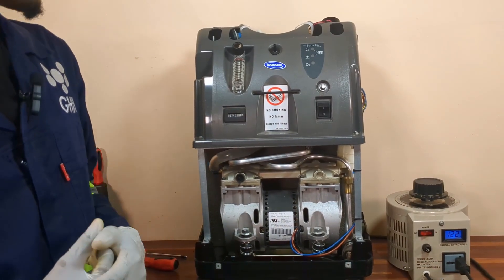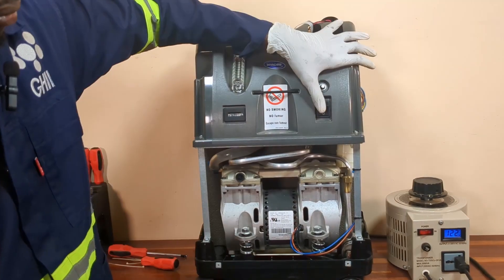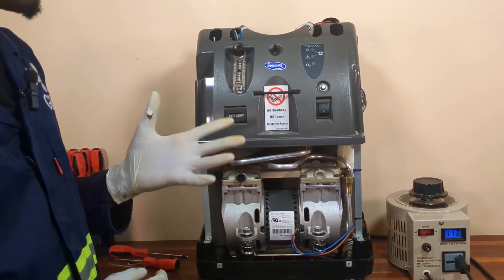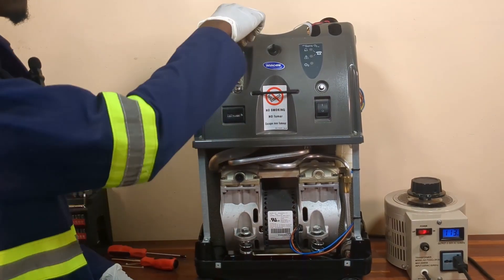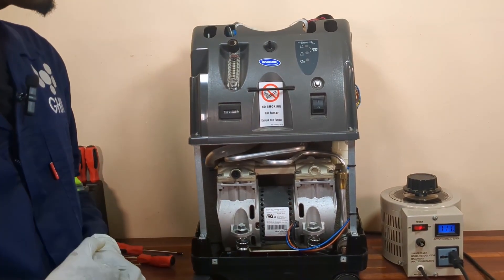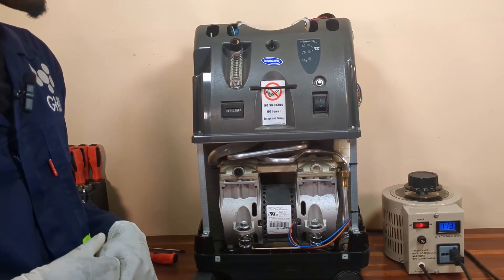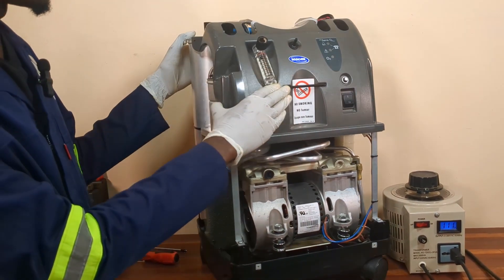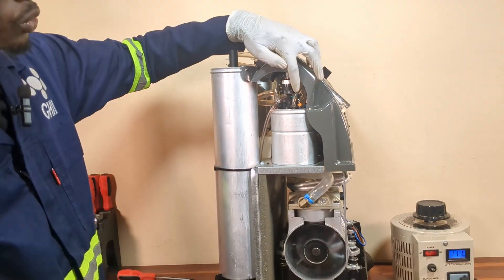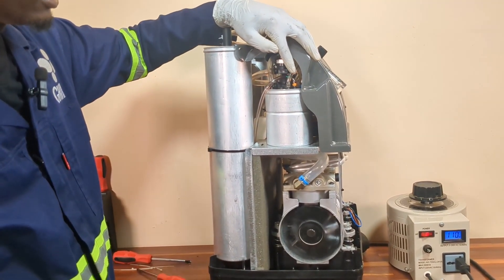To simulate low pressure conditions, I will power the oxygen concentrator using the variable transformer. After doing that, I will set the flow rate to the maximum, which is five liters per minute. Moving forward, I will create a leak within the system, specifically on the product tank. To do that, I will disconnect the tubing going to the pressure transducer. This is the tubing going to the pressure transducer — disconnecting this tubing will create a leak on the product tank.